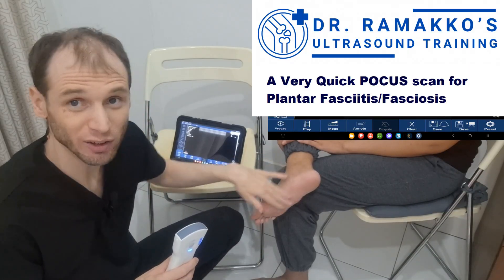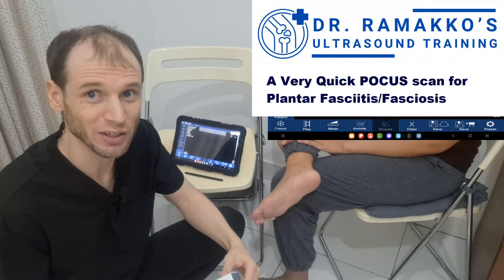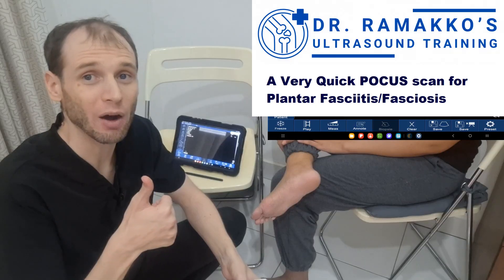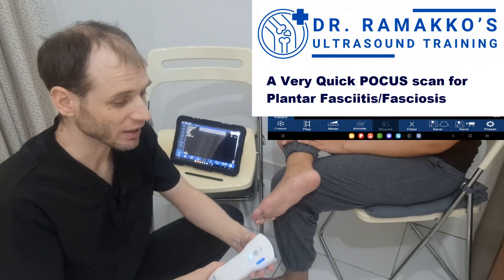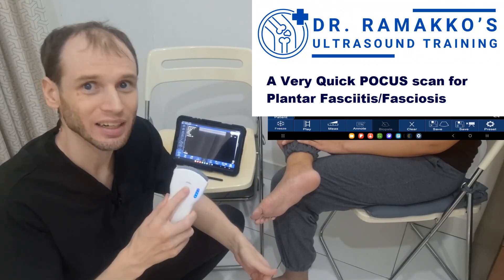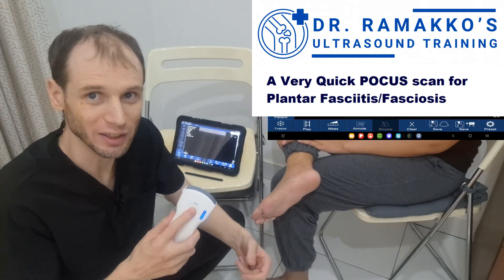The plantar surface itself can be a little tricky to scan because it's hard to get penetration sometimes through that thick skin. You may have to increase power or decrease frequency in order to see anything. In fact, I've even had to go down to like five megahertz with the curvilinear side just to get the penetration to measure the plantar fascia.